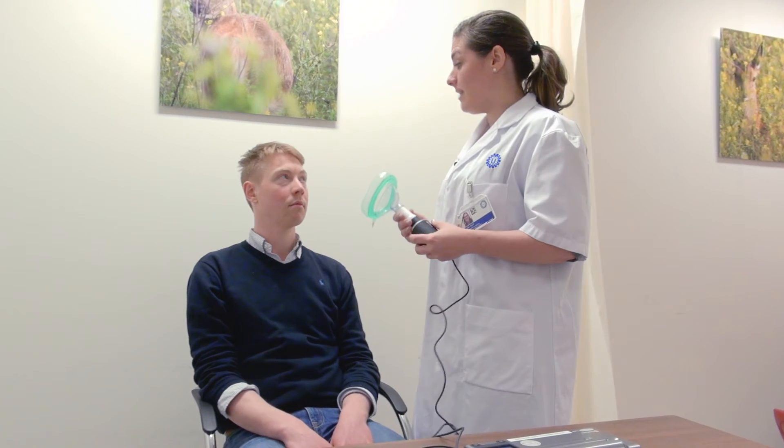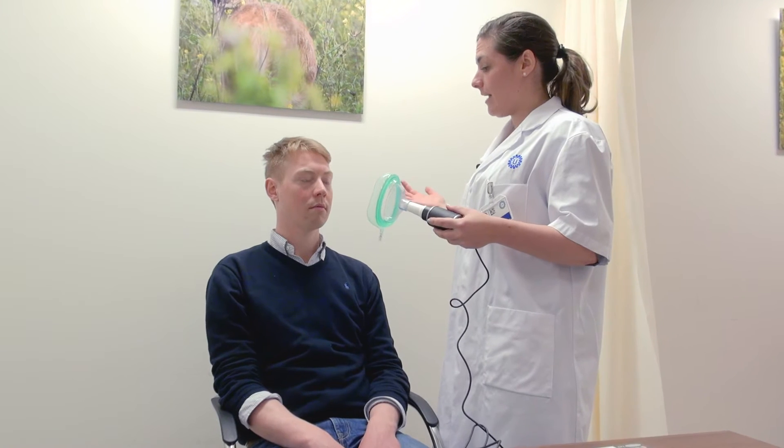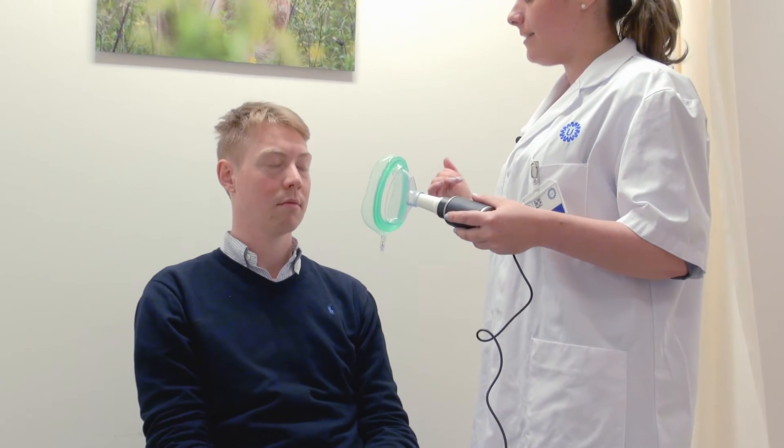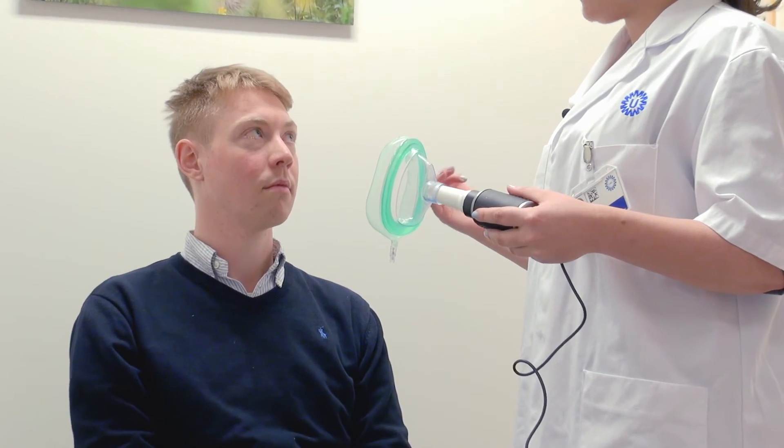I'm going to place this over your mouth and place one hand on the back of your head. This way, there will be an air-tight seal around the mask when it's on your face.